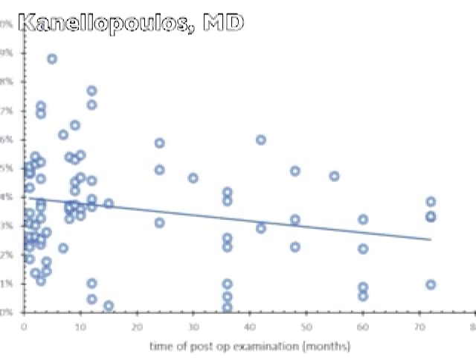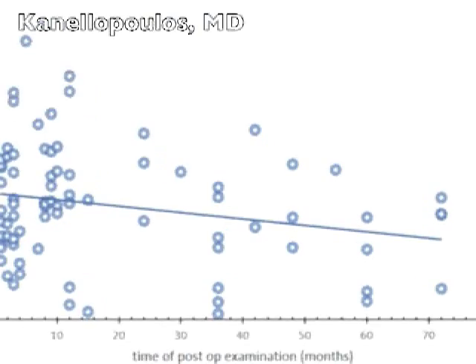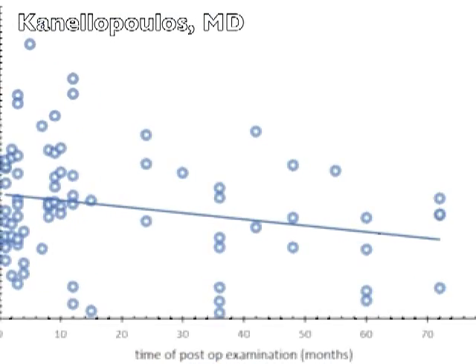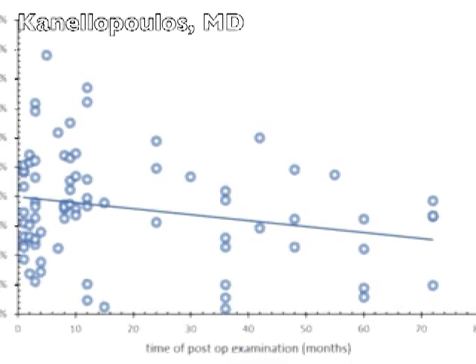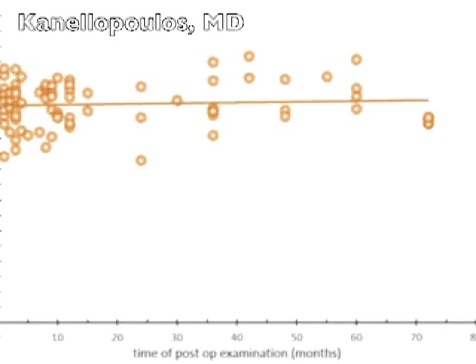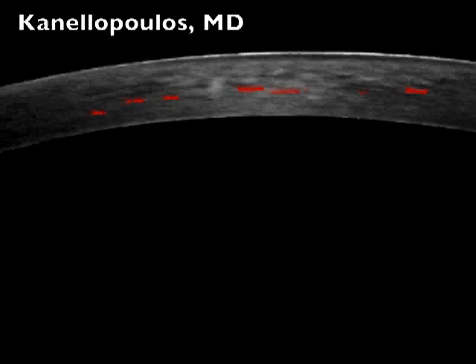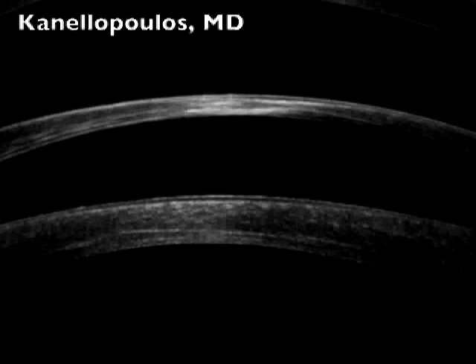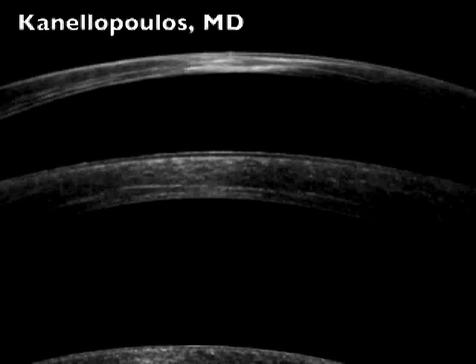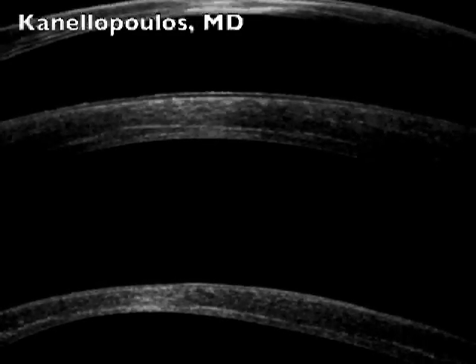You can see here, also noted in the paper, the wide range of follow-up all the way from early follow-up, first year, to 5 years. And as I noted previously, most of these cases are Athens protocol cases. Here you can see the actual demarcation line depth with ranges from 50% to almost 90%. The average is about 70%. And these are clinical examples noted also in the paper. Some extremely thin corneas cross-linked. You can see demarcation lines range from almost 90% to 50% in other cases.